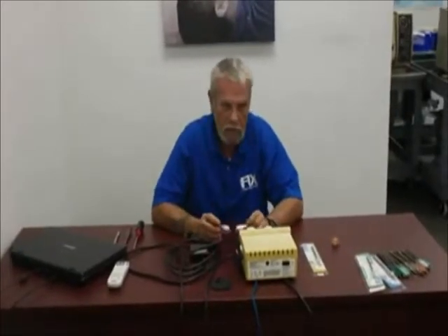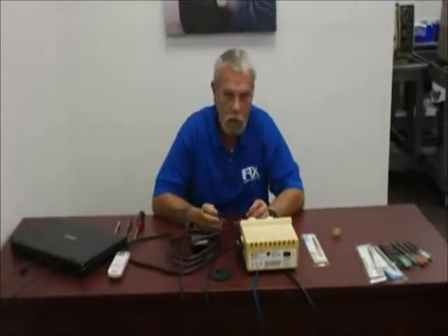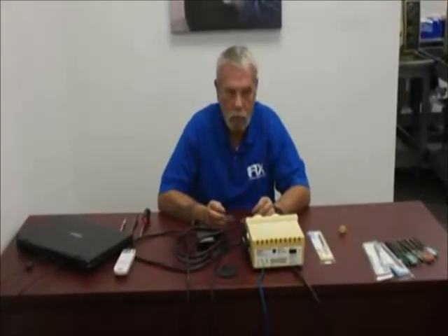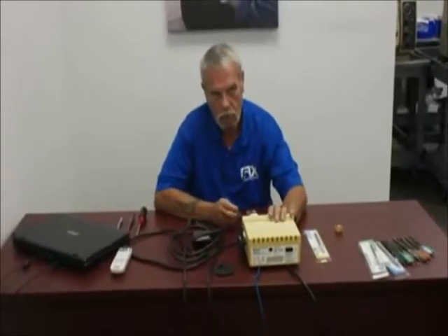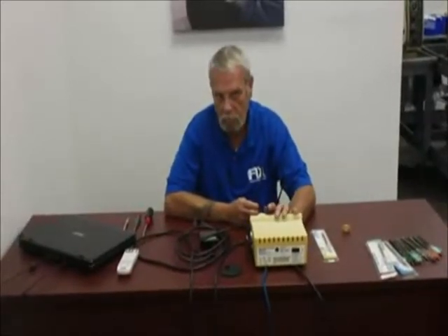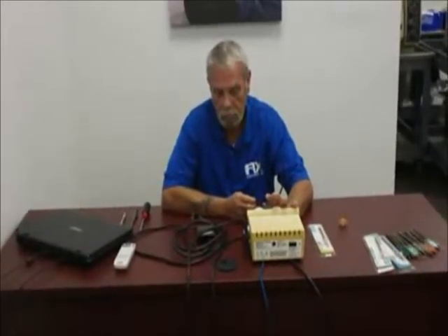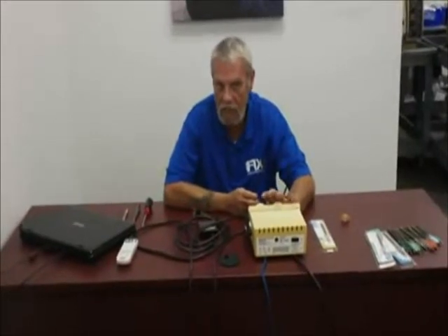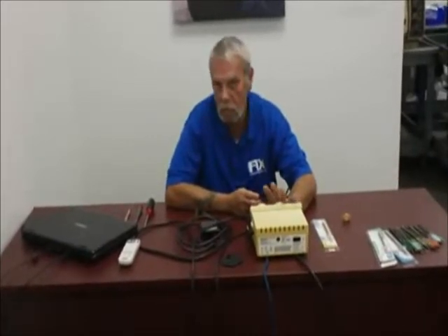Most of your bigger companies, whom shall remain nameless, don't work on cavitrons in situ — in the office or in the operatory. They offer a repair service at a central repair facility. The cavitron is not an essential item in a dental office, meaning they cannot work without it. If the cavitron goes down, there will be much grumbling from the hygienist because she has to hand scale.